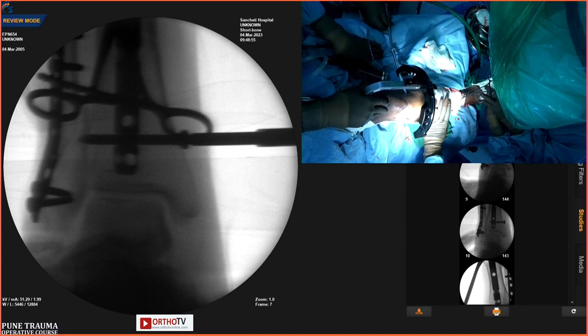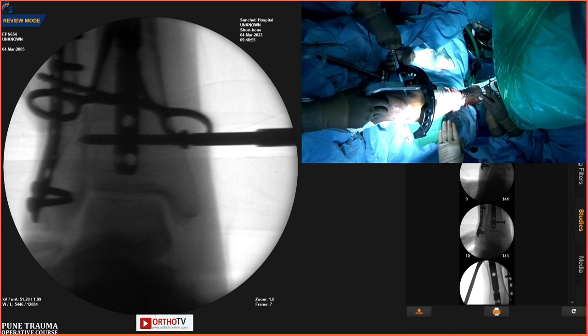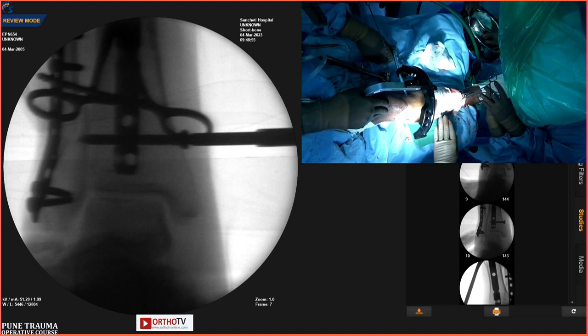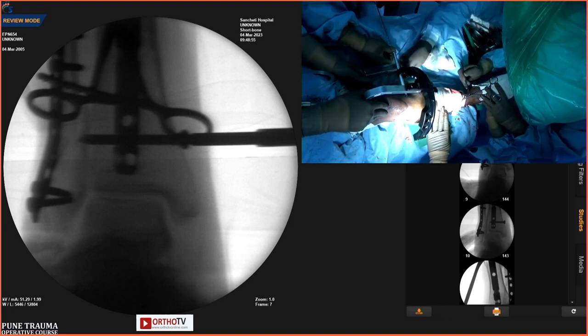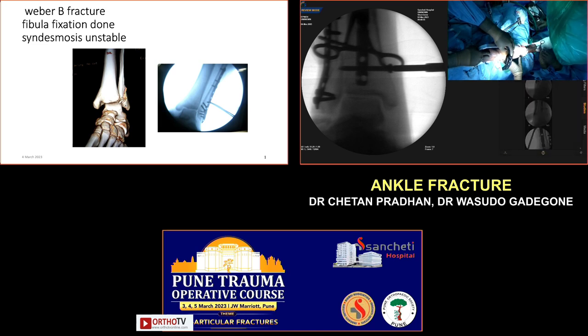Okay. In this X-ray, you can see the distalmost hole looks like a double hole, figure 8. So it can be locked 30 degrees from the lateral side or 30 degrees from the medial side. It's not a straight anteroposterior locking, it's an oblique locking. What is your preference? You go from anteromedial or anterolateral? Both can be done. So what is your preference? How do you decide that? I go from the medial to lateral, anteromedial to posterolateral.